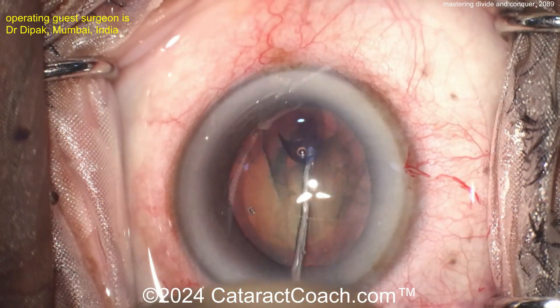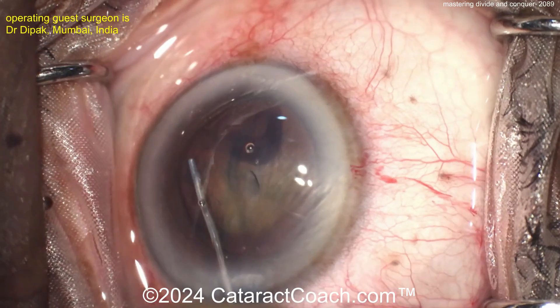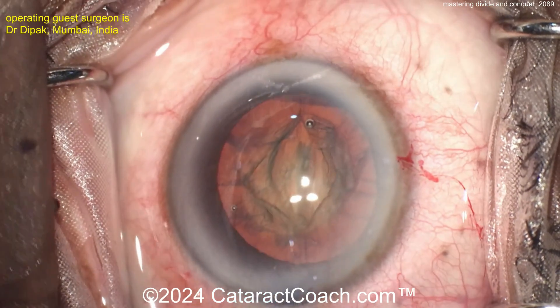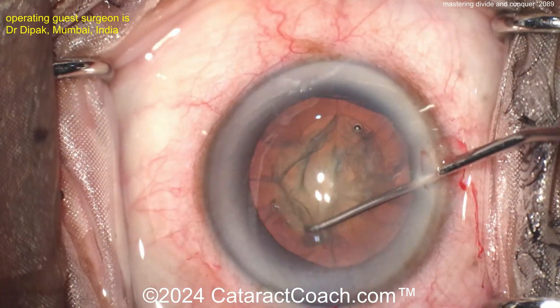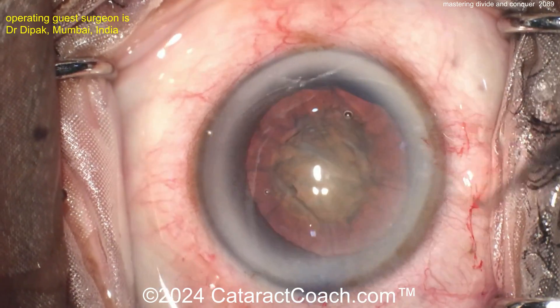Here's hydrodissection — very important to get good hydrodissection. Why? Because you have to rotate the nucleus for divide and conquer. My saying: if it does not spin, you will not win. There's a little more viscoelastic going inside the eye. Let's get this thing spinning. Sinski hook through the side port — you can just rotate with the cannula from hydrodissection, but you can use a Sinski too. Look at that beautiful spinning.